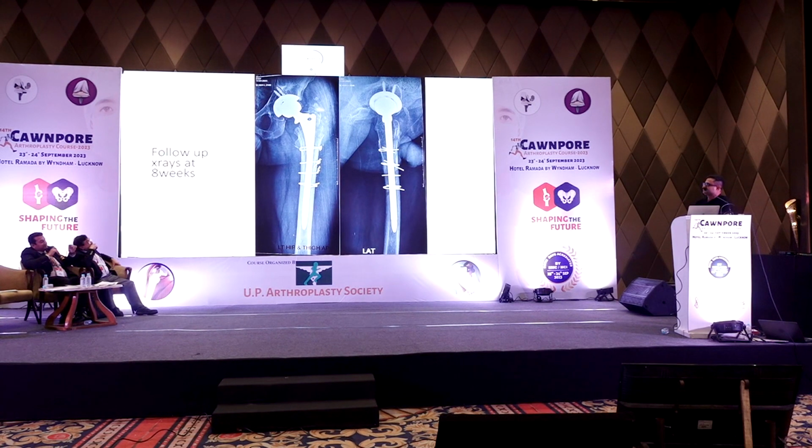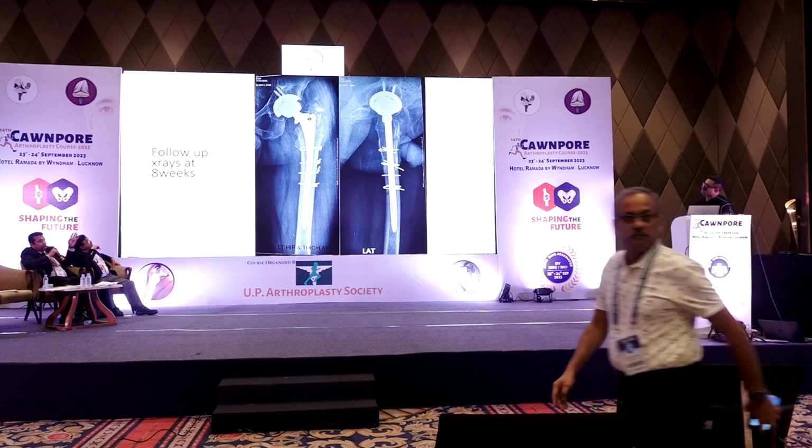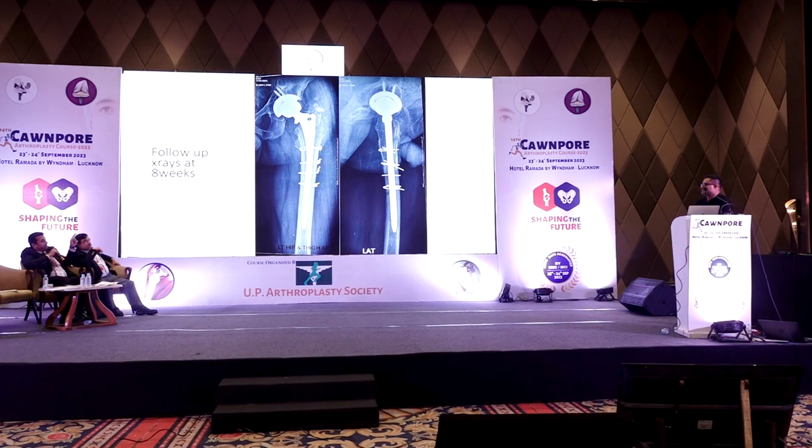Okay. So it's just a matter of time, I think it might become loose further. Sir, this cup, you need to wait and watch. This should have been revised day one.